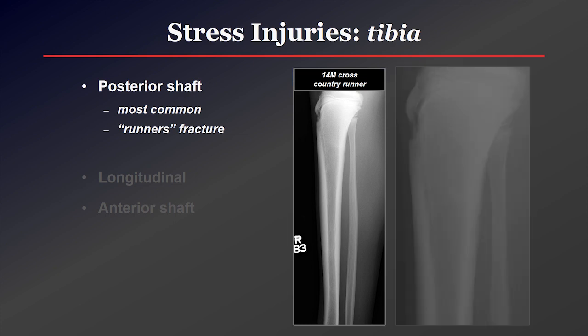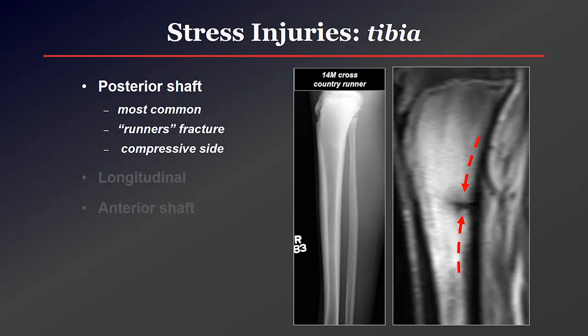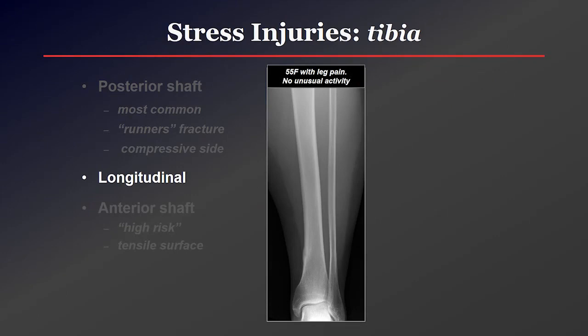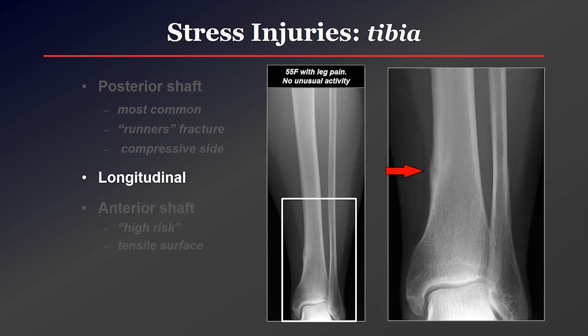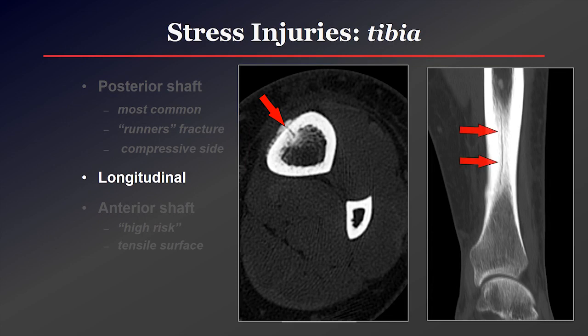Looking at the tibia, the posterior shaft is the most common area for a stress injury, known as a runner's fracture. Much like the femoral neck, these do pretty well because that's on the compressive side — the posterior tibia has a concave margin, and these go under compression with weight bearing. Longitudinal fractures are much less common but do occur. Here's a 55-year-old without a significant activity history where we see periosteal reaction and cortical lucency suspicious for a stress injury. She underwent a CT, and you can see the fracture line in the anterior tibia shown to be a vertical longitudinal stress fracture.